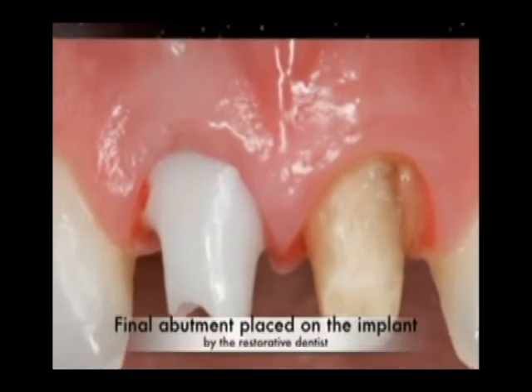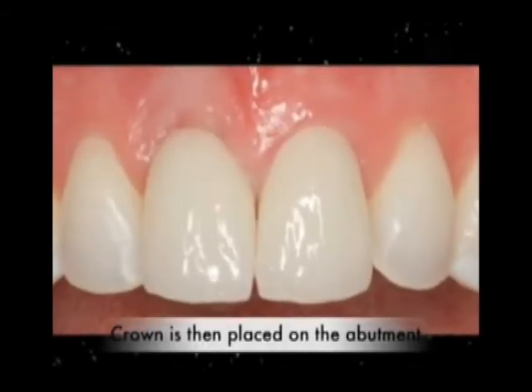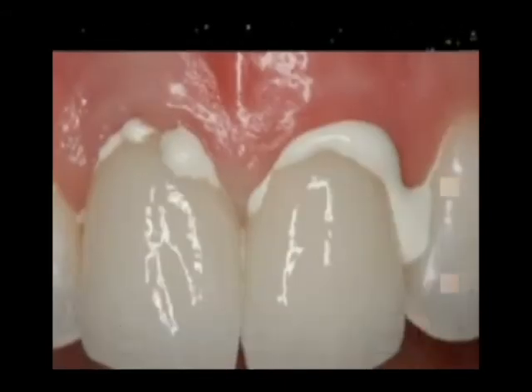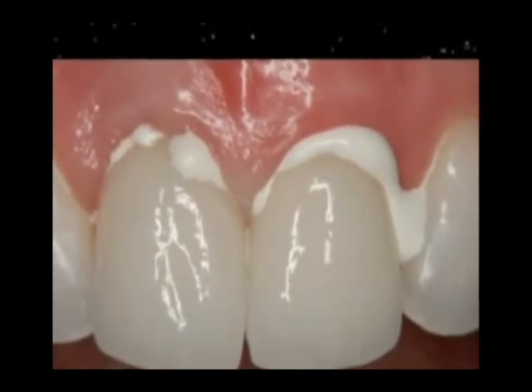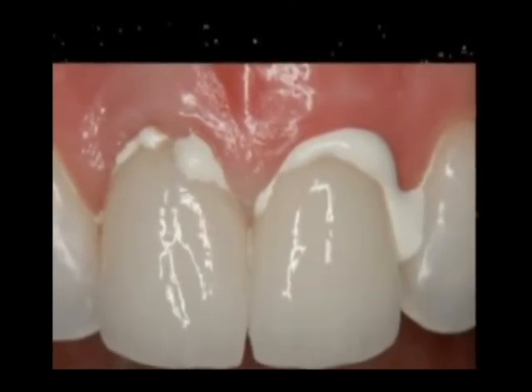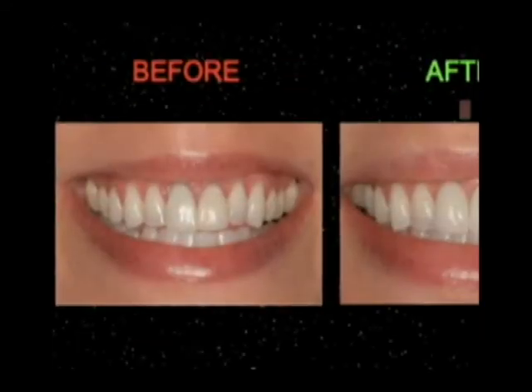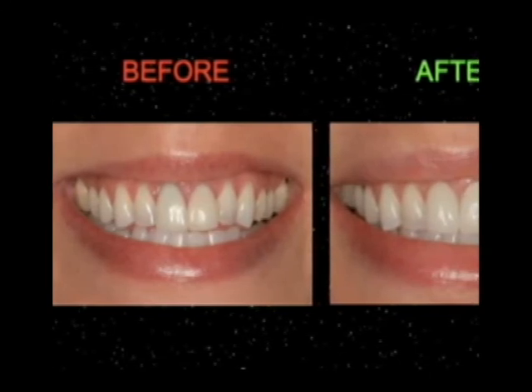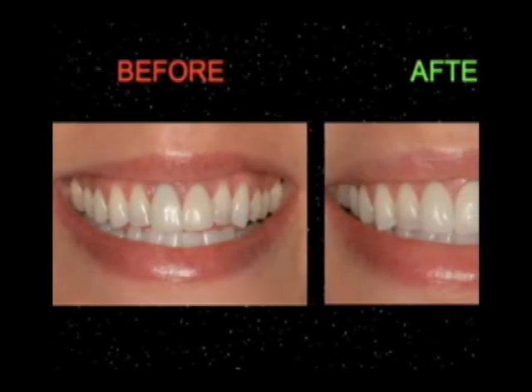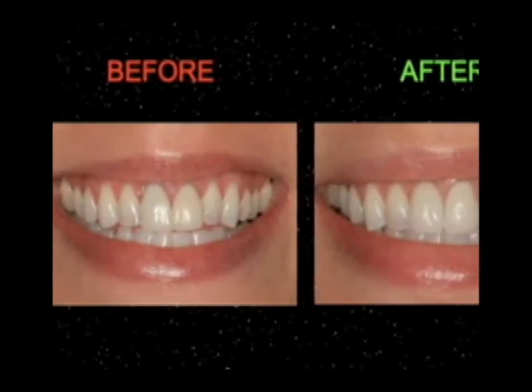We're able to place the abutment or the post on the implant and then the crown on top of that, using the right combination of cements to cement both crowns, one on the natural tooth and one on the implant, to make them look identical and have the same gingival contours and the same aesthetic look, so that you can see between the before and after shots that she gets a very pleasant result with the high smile line.